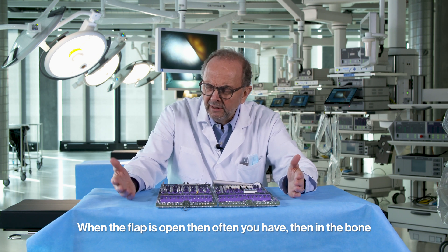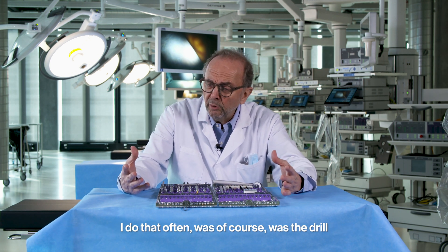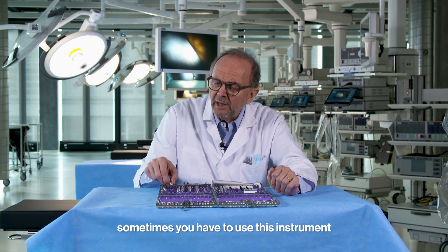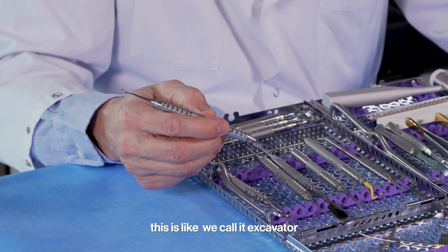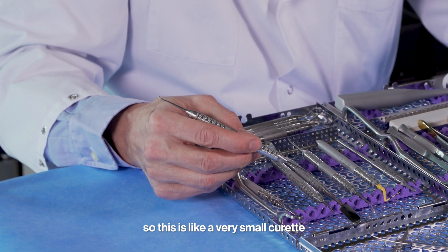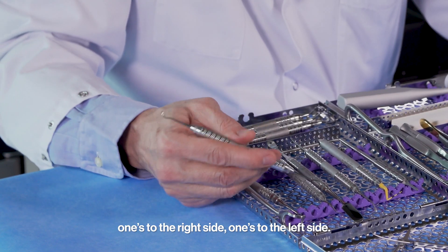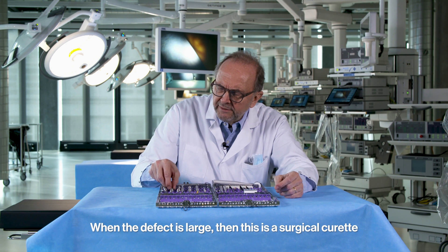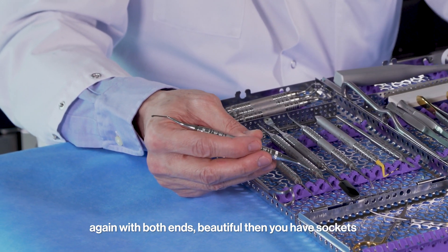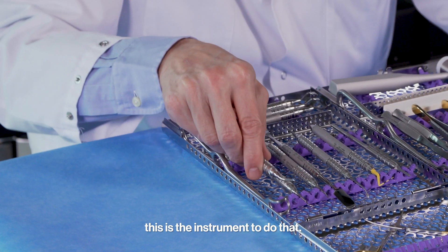When the flap is open, you often find bone defects with granulation tissue that must be cleaned out. I use a diamond drill to smooth the area, but sometimes you need these instruments. This is an excavator — originally from operative dentistry — like a very small curette with two ends, one to the right and one to the left, to get into small defects. For larger defects, this is a surgical curette, again with both ends, ideal for cleaning sockets after extraction.